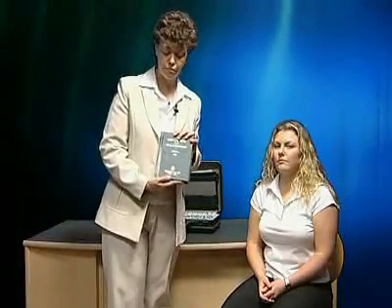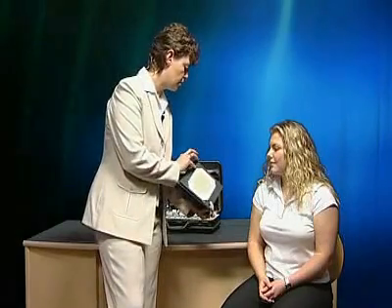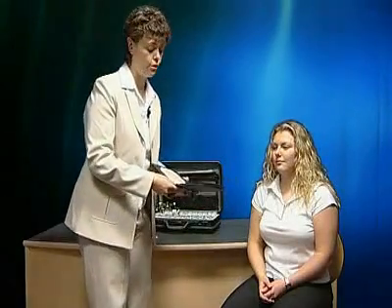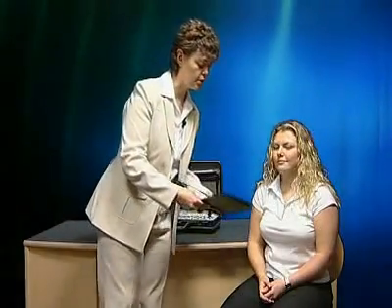We're going to use the Ishihara test and get Zara to look at several plates. What we're most interested in are the plates that Zara can't see — these will be the plates we'll use in conjunction with the filters. Zara reads some plates correctly, but on two particular plates she sees nothing. These are the two plates we're going to use.